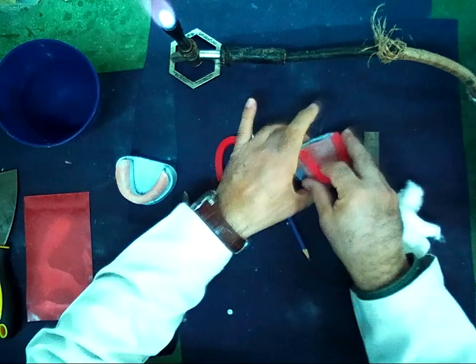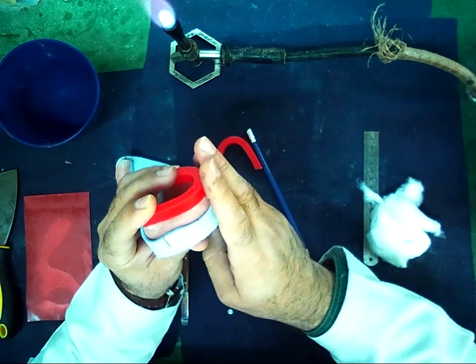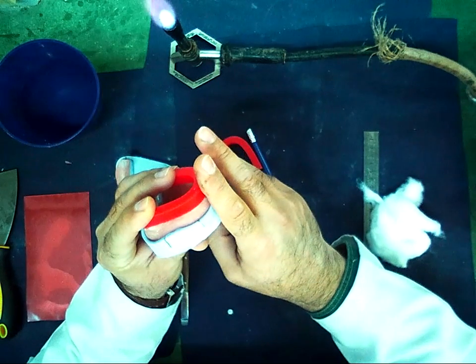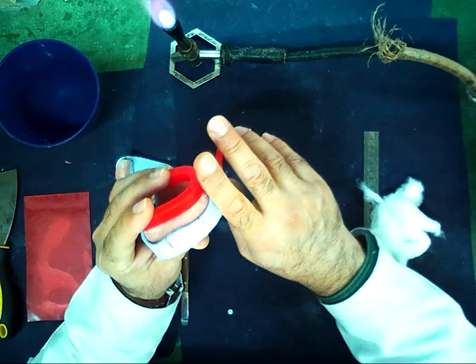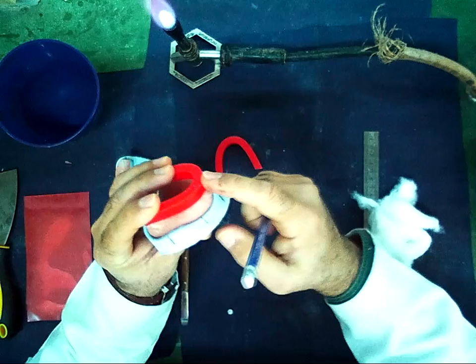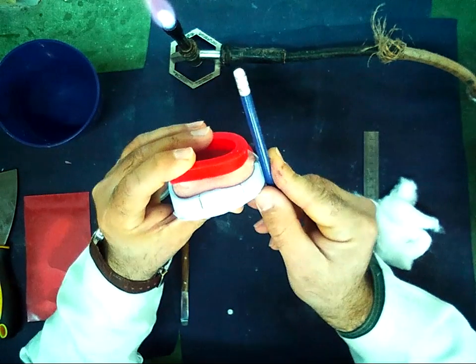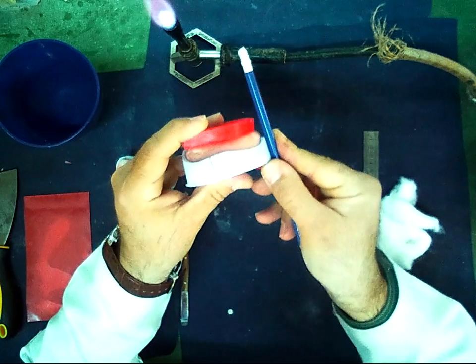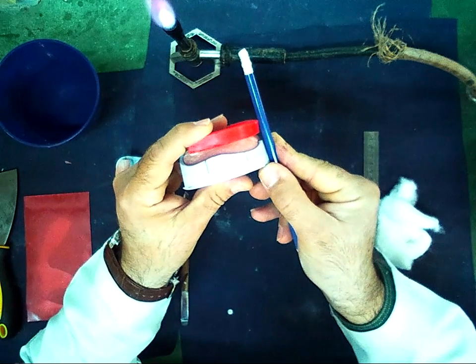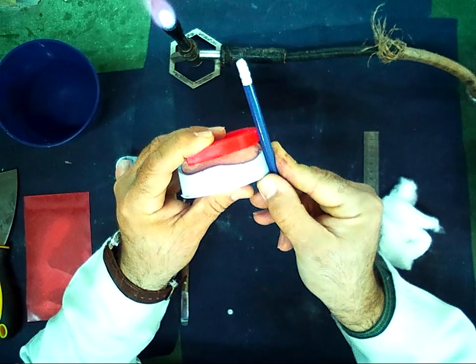Also, the upper trim should have labial incline. The labial inclination should be 2 mm. It should be at the same level as the cast. When I put the pencil like this, it should touch. It should touch the pencil. This is the incline.